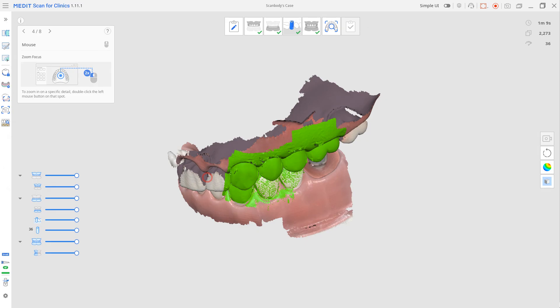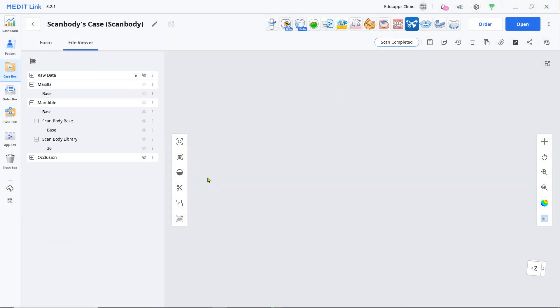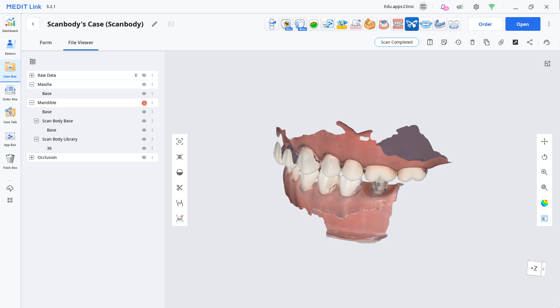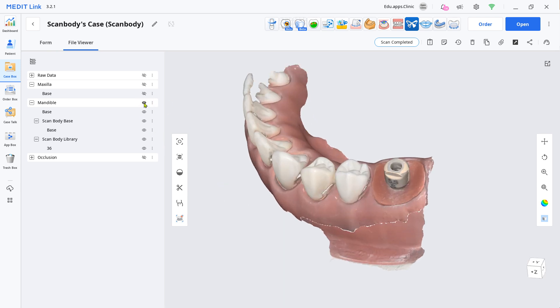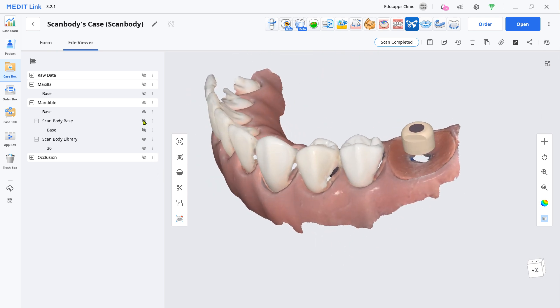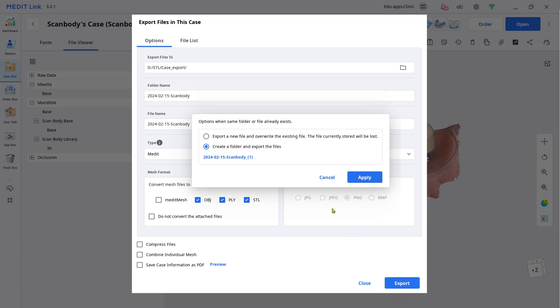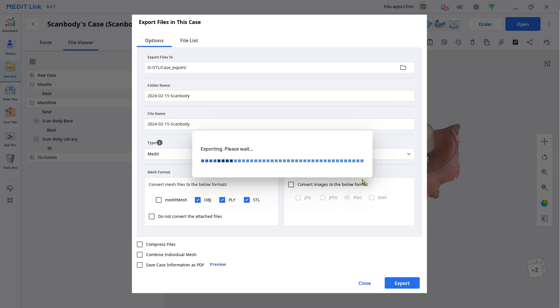Click Complete to save. Choose As Is. In the File Viewer tab, you can see the aligned scan body. Check your scan quality and export it to send to your lab.